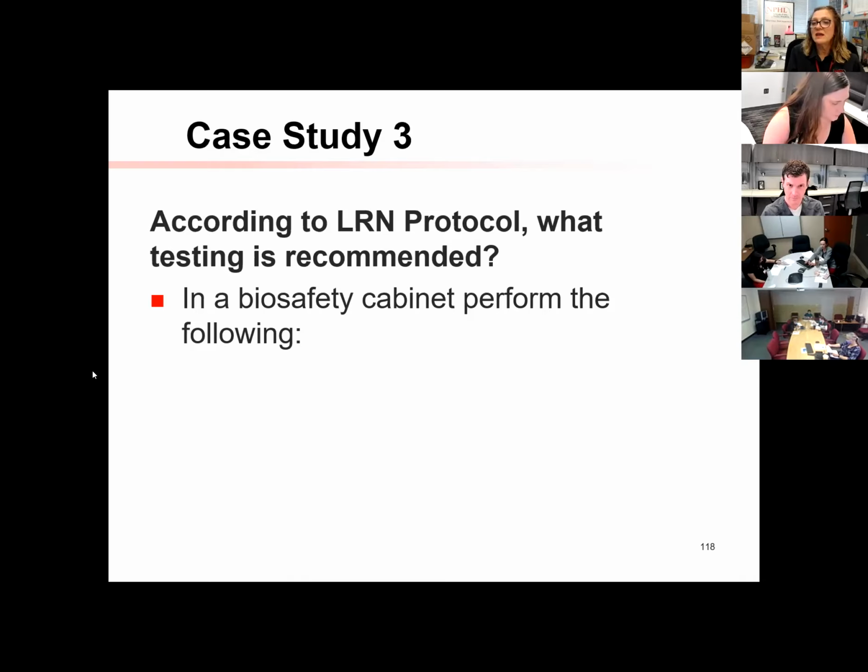And if you think about it, it's probably going to be the same group that we were on before, right? Yeah, so it would have to be either the Francisella, the Brucella, or the Burkholderia mallei. And really thinking we're in the United States, maybe we could bring it down to just Brucella and Francisella. So what tests can you do? And I have always said oxidase, always start with oxidase. So if I were to tell you it's oxidase positive, now, what is your suspicion of those three organisms? That might be enough to either rule it in or out.